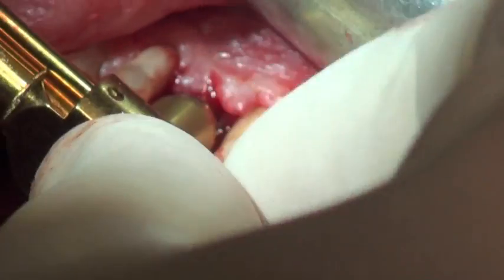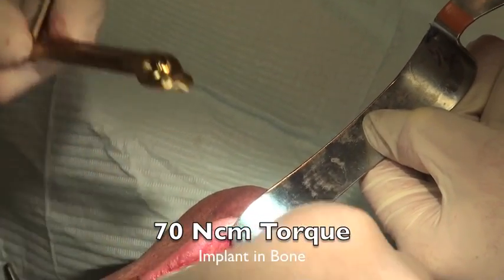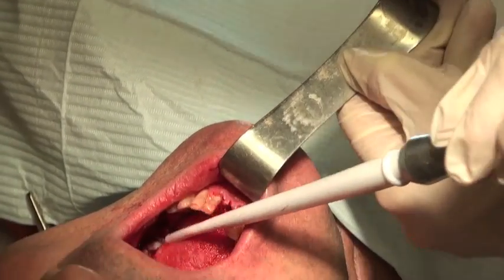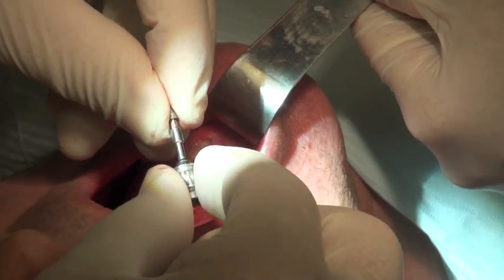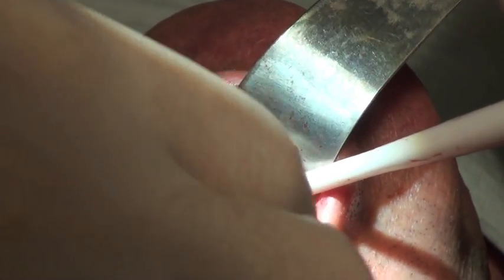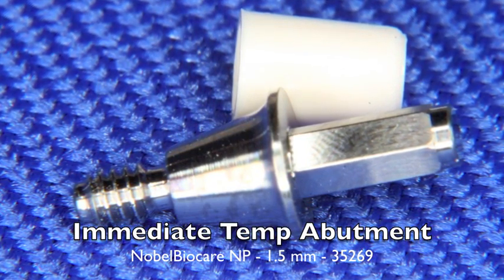The next thing is to check the torque of the implant. Prior to placing an immediate temporary abutment, we need at least 35 Newton-centimeters. Here we're measuring 70 Newtons of torque, which is quite typical and is actually recommended by the manufacturer. To carry the immediate temporary abutment to the mouth and insert it into the implant, we use the Unigrip driver, separating it off the torque wrench from the prosthetic kit, and screw it in to get the abutment in place and ready to be torqued.